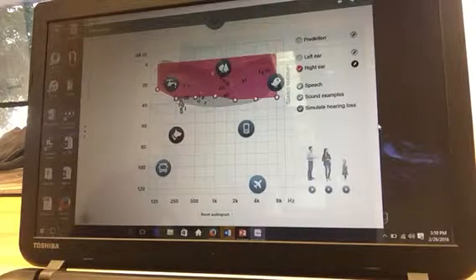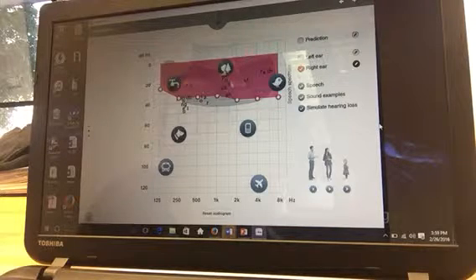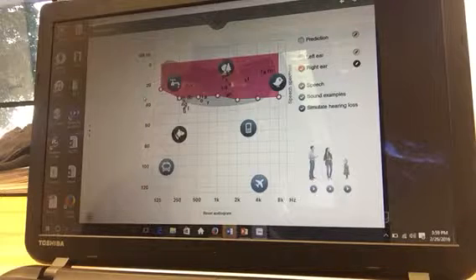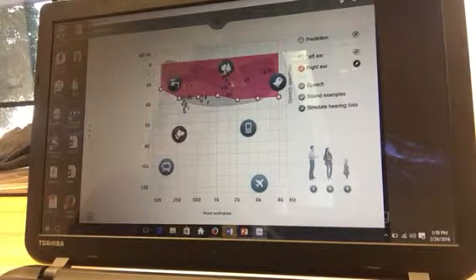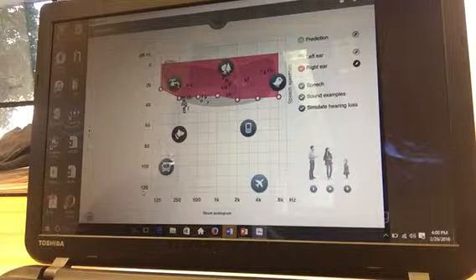Good afternoon. Before I get to the results of your child's hearing test, I would like to explain the layout of the audiogram first. On the left-hand side, you have the decibels, or the loudness, starting at the top and proceeding to the bottom. The lower on the graph, the louder the sound. So it's kind of like a remote where you raise the volume. So up here you're going to hear the softer sounds, and as you get lower it's going to be louder sounds.